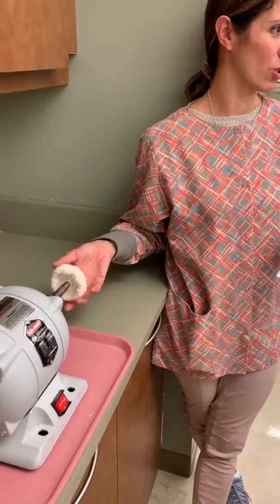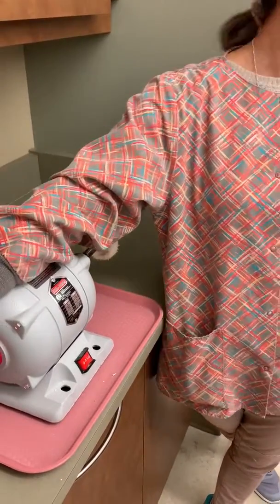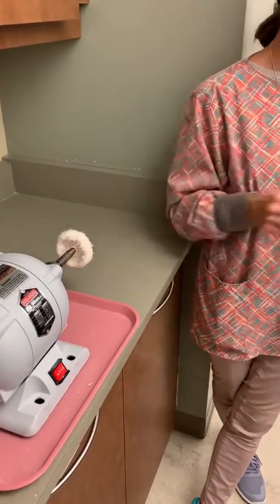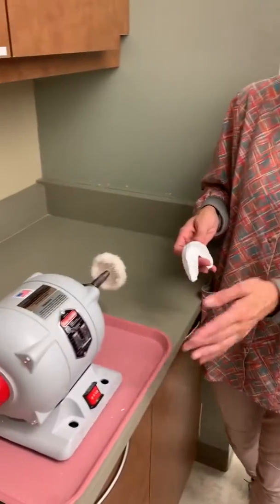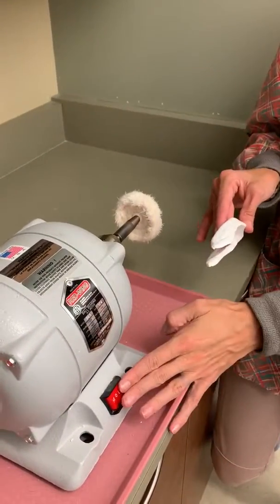Sometimes this lathe is used to polish up acrylic, sometimes it's used to trim models or custom trays. We use the cloth wheel to smooth out the edges on a mouth guard if it's available. It's a quick way rather than using the torch and knife to smooth the areas.